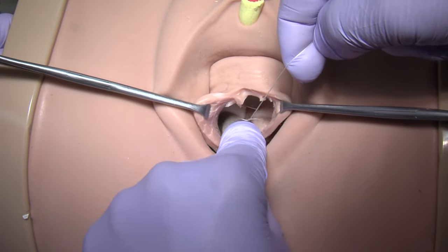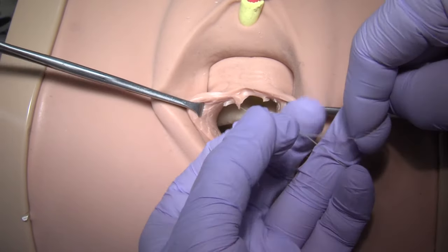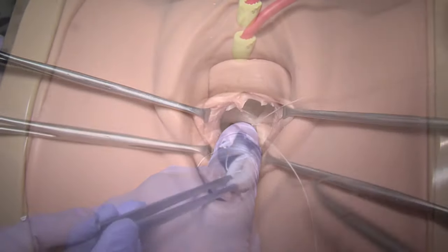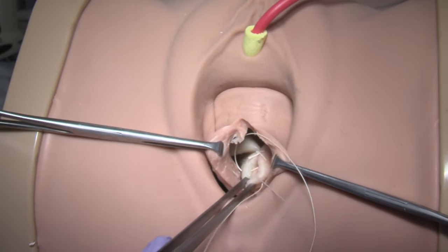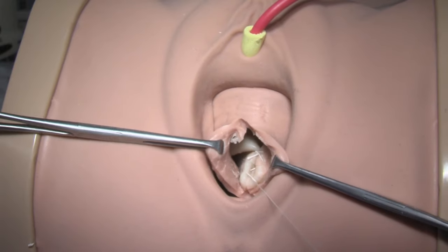Surgical tips: Avoid tension and avoid taking excessively deep bites to prevent injury to the underlying trigone and ureteric orifices. If the prolapse is particularly large, consider placing an initial purse string suture.